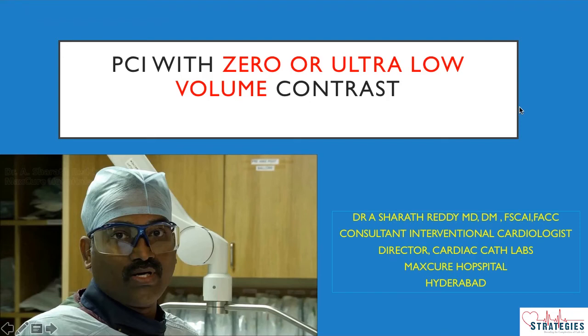In this section, I will discuss a case which we have done in an elderly male with renal failure. It's a percutaneous intervention with zero or ultra low volume contrast.